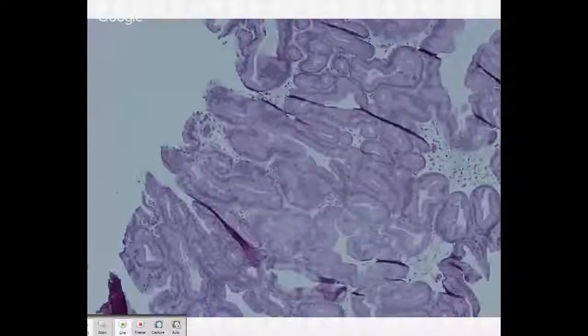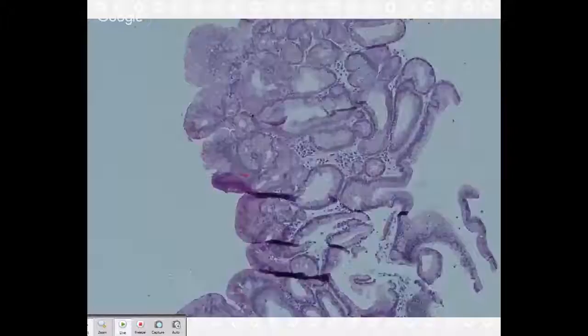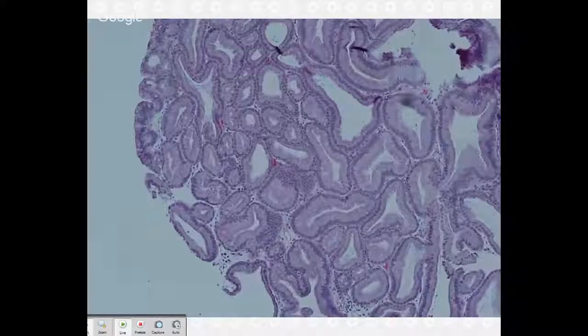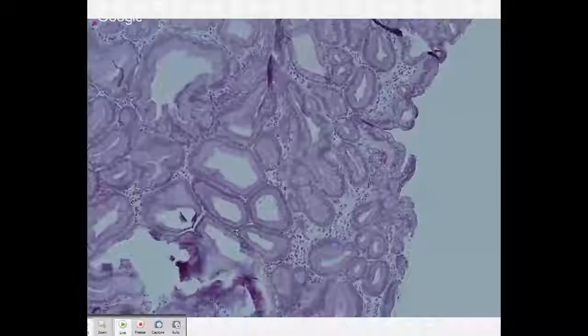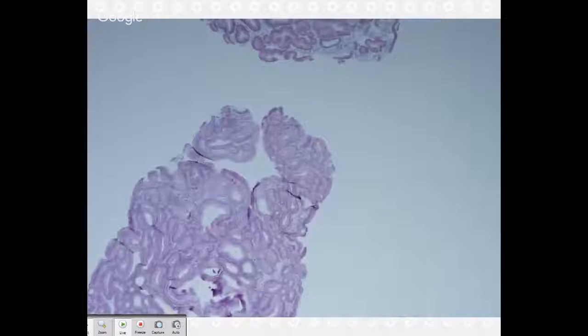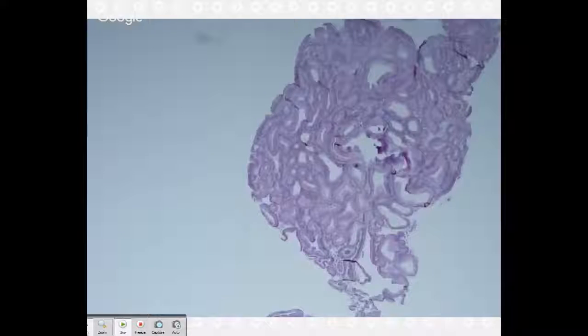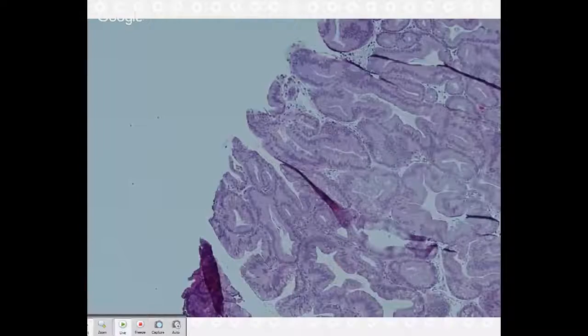Oh, that's an interesting thought. So it could be part of a syndrome. You can see these in patients with familial adenomatous polyposis, which is probably why I said he had multiple polyps. Gardner syndrome or something like that. Because there is atypia also, as you say, in the top, right? Like low grade. Yeah. So I think by definition this has a little bit of atypia to it, that it is a dysplastic lesion.